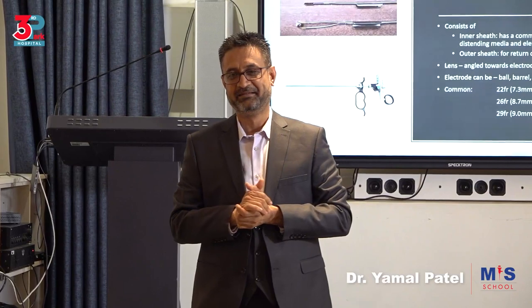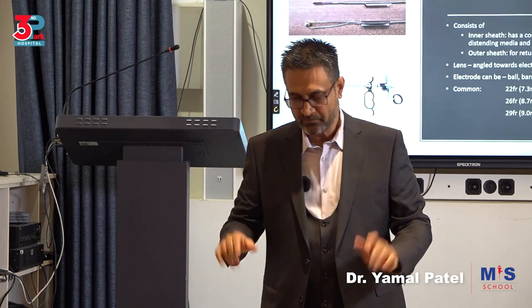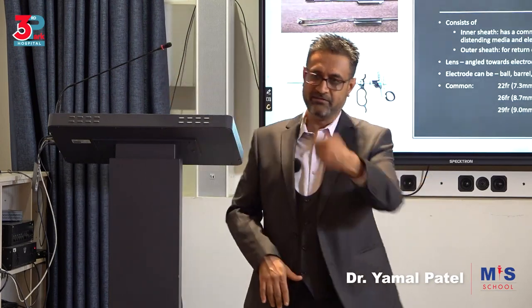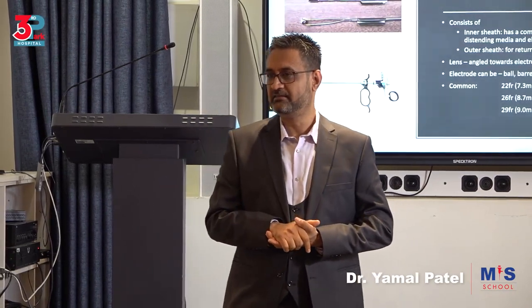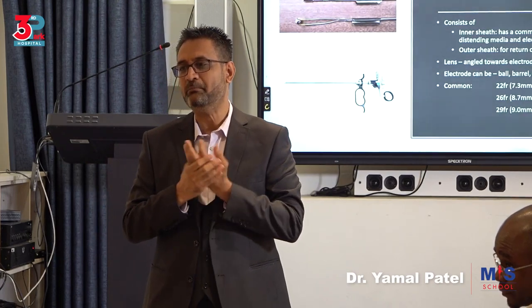You know what I mean. You're using saline to do hysteroscopy, right? You've used a monopolar resectoscope by mistake. You were not told this is bipolar. You are given a monopolar resectoscope because those are the old ones that we always have been having. And you activated a monopolar resectoscope in the patient while it is in the uterus. What happens? Any guesses? It's okay, yes. It will burn.